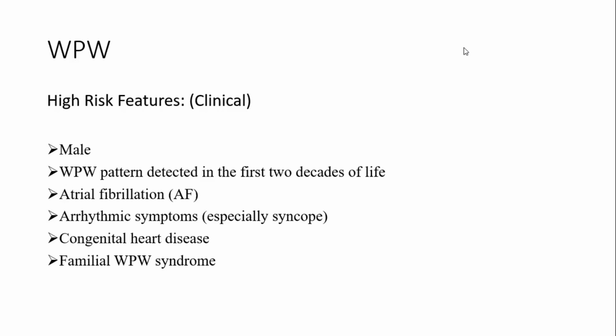They present with the right bundle. Always look for pathways in case of tachycardia in these patients, and familial cases. So these are the high risk features. These are the clinical features, but they might ask you the ECG features.